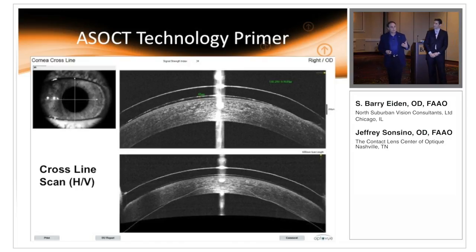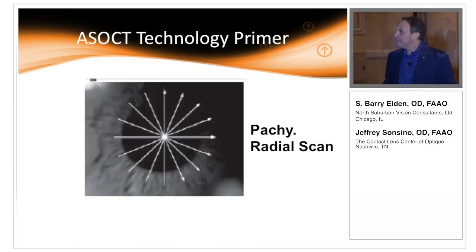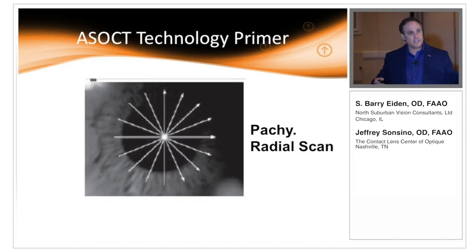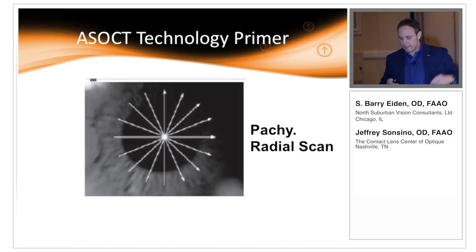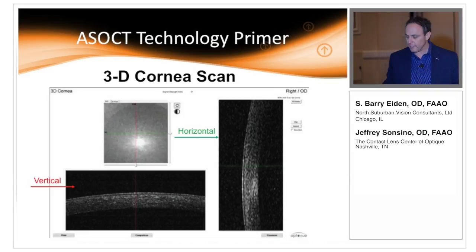A radial scan is something I've been experimenting with based on suggestions from others who use this system. As you can see here, you get all these radial cuts, and when we get the actual image we can rotate that cut along the cornea, going around the clock 360 degrees.